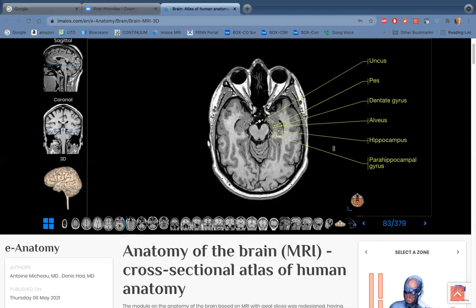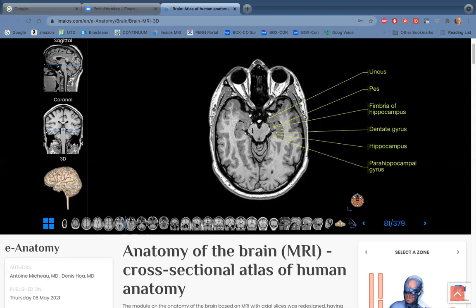As we move superiorly, we expect that pons to change shape to the midbrain. The midbrain looks something like a butterfly shape because it's associated with structures called cerebral crura, which are large white matter tracts going to and from the midbrain to the cerebrum. At the level of the midbrain, when it looks like this, we're going to learn to recognize the right hippocampus and the left hippocampus — structures very important in memory. This is considered the medial temporal lobe. We're all right temporal lobe, all left temporal lobe, with occipital lobe in the posterior aspect.